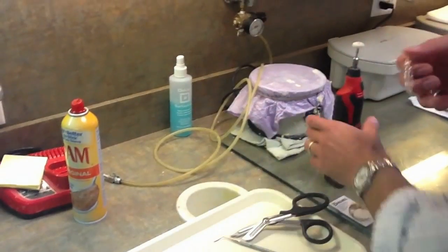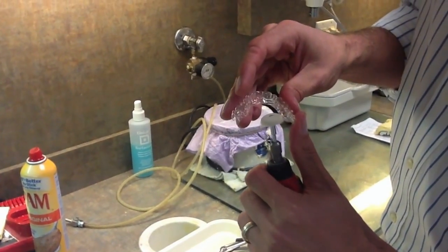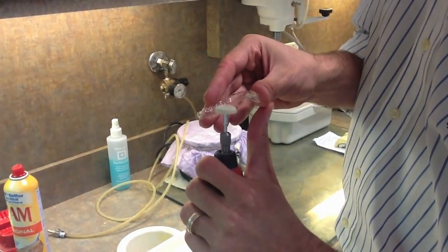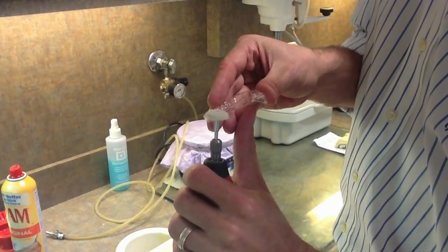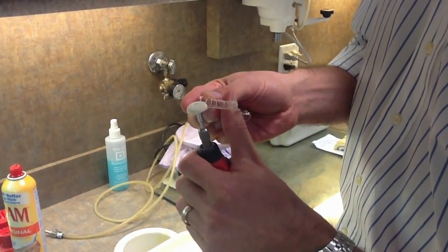The last step is to pick up the Dremel tool and go all the way around the model. The great thing about this felt wheel is that it actually slightly heats the edge and melts in sharp points, which makes it nice and smooth for the patient to wear. Just going around the model a few times makes it really nice and smooth.